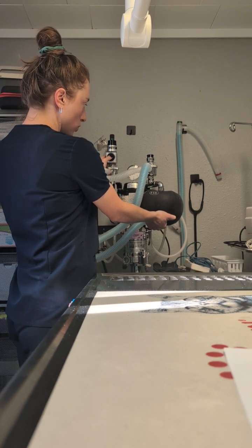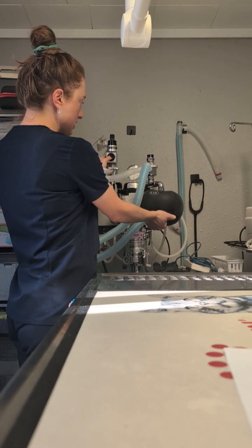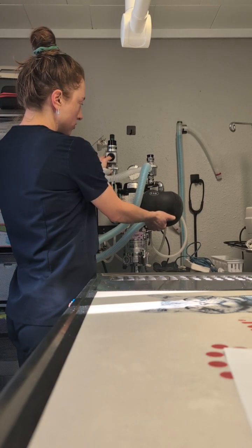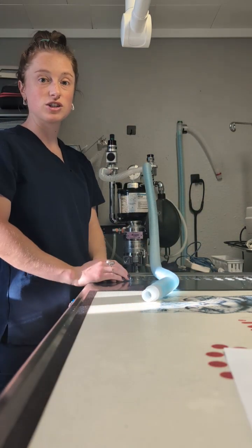So it's pretty much holding right around 20, which is good. I want to hold it for at least 10 seconds to make sure that that pressure doesn't go down. And then I can go ahead and release. And so that is a good pressure test on the system.